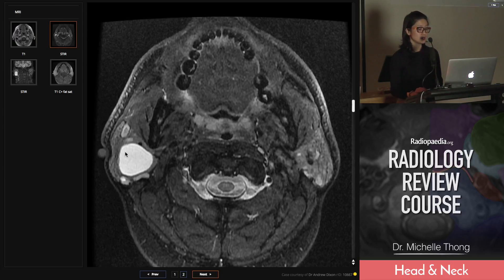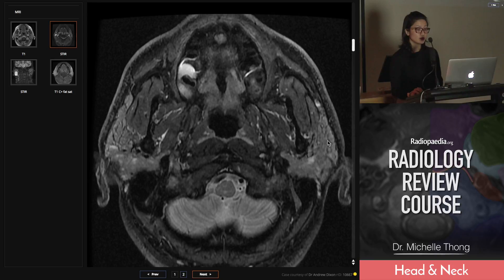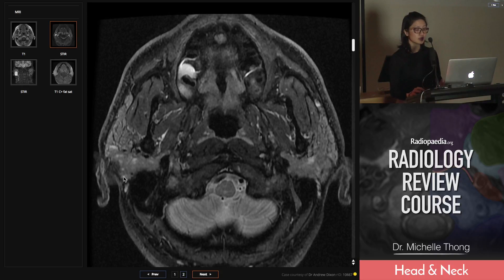You can see on the T2 the lesion that brought the patient to our attention, and the background of this multiple, very heterogeneous — almost a polka-dotty look to the parotid glands on both sides — and they look subjectively mildly enlarged. So this is a diffuse parotid process.